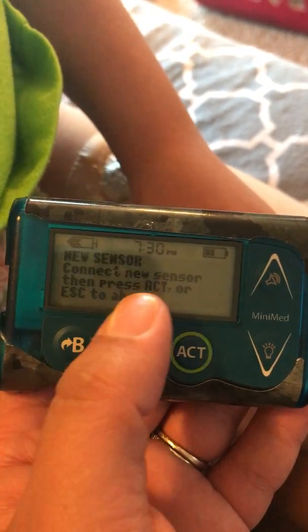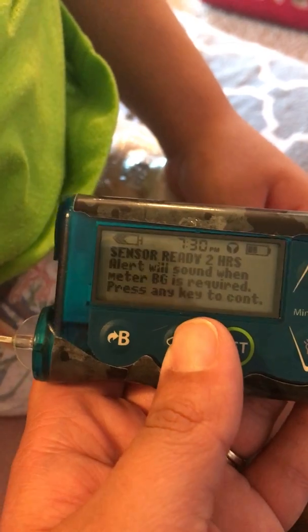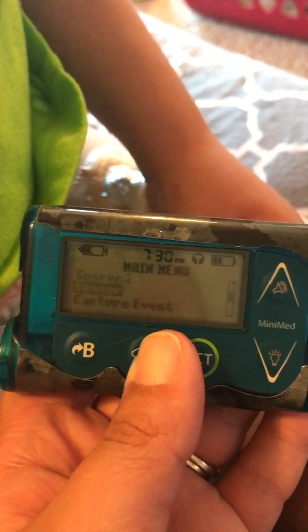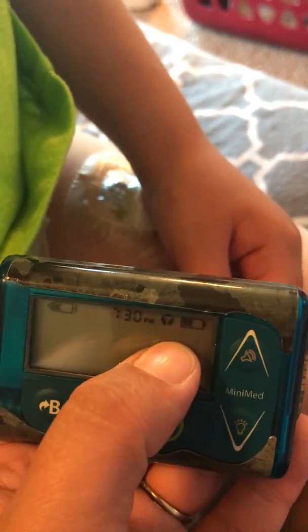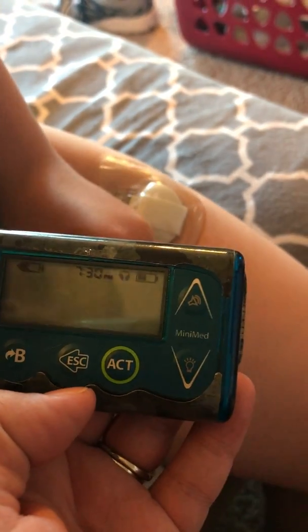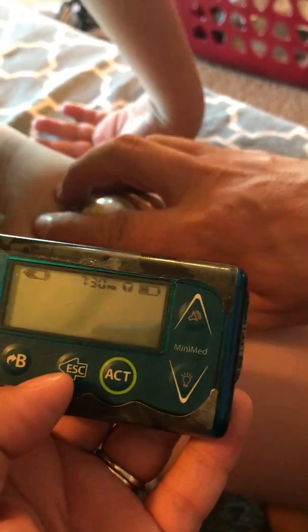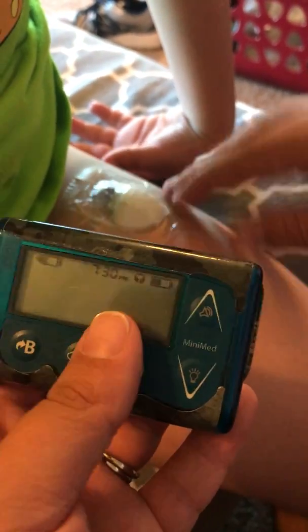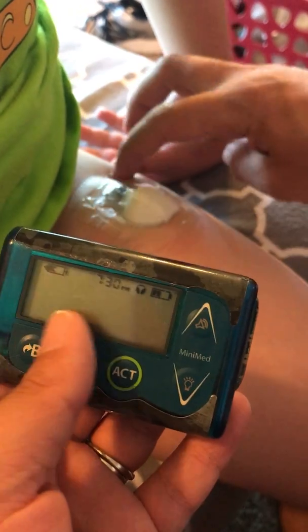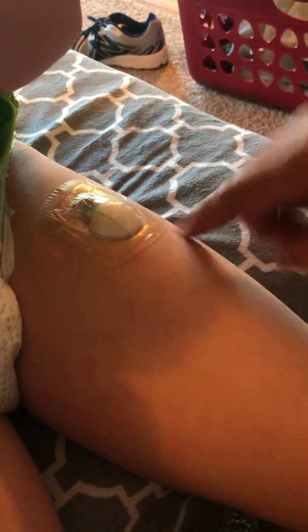And it will say press Act. So we did Act, and it's going to be ready in 2 hours. You can escape out of all that. You know it's warming up because you have that symbol right there. The best time to do this is usually after breakfast in the morning, so it's ready by lunchtime, because then you can get a pretty good calibration and not have to worry about it calibrating weird. So again, the best time is in the morning, after breakfast.